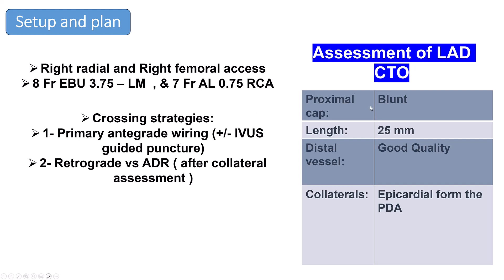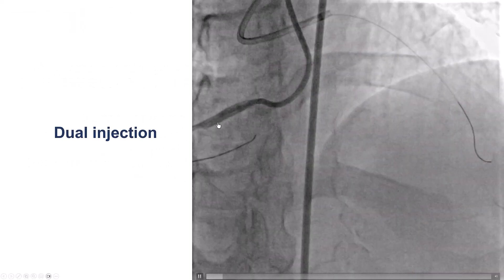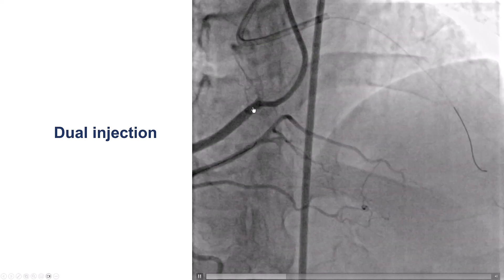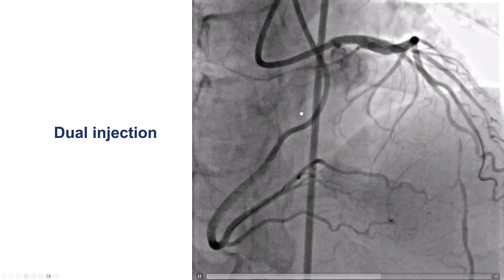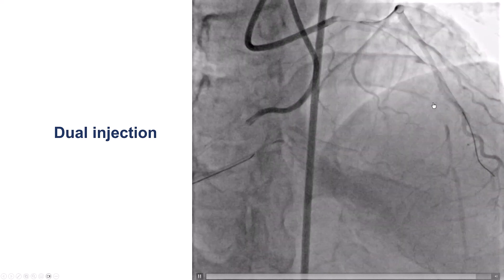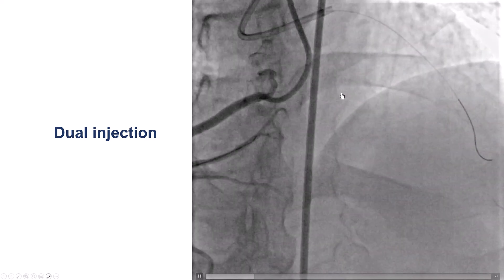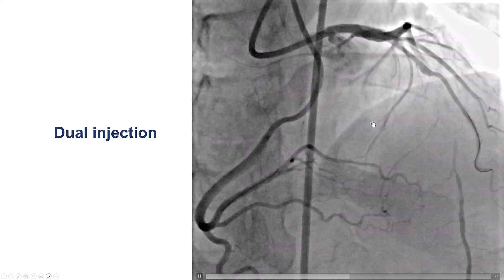So how to approach this lesion? We know that we have a blunt cap, we have good quality distal vessel, the collaterals seem to be epicardial, so we decided to go with dual access using the radial and femoral, with plans for antegrade crossing, potentially using IVUS to guide our puncture, and retrograde or ADR only if the antegrade crossing failed. This is the diagnostic angiogram with dual injection. The remaining vessels look fairly good, so it's very interesting that the patient had isolated disease in the LAD. We have the CTO of the proximal LAD right at the takeoff of the diagonal branch.